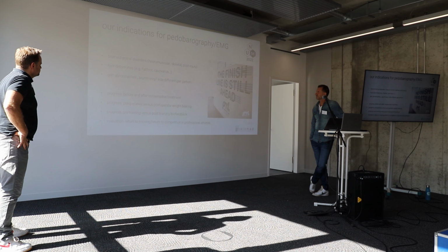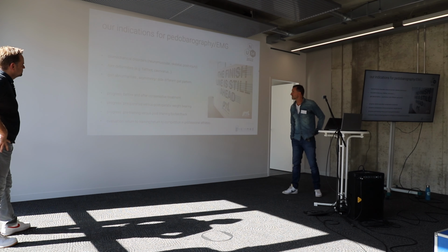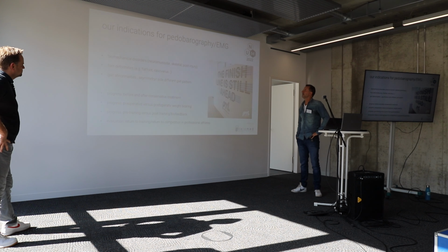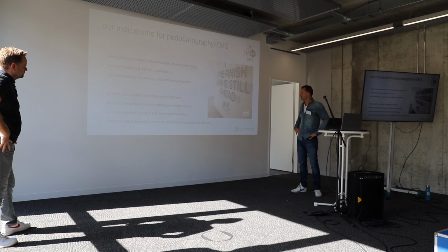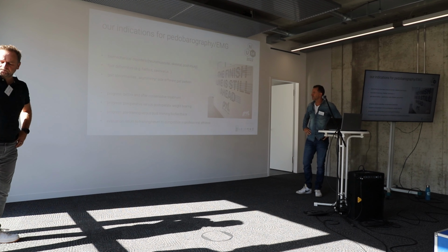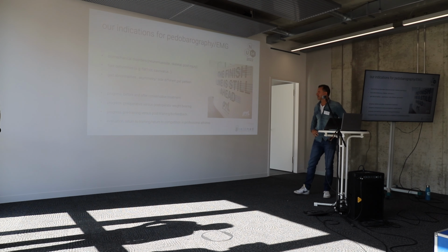In general, for me as a foot and ankle surgeon, it's everything of biomechanical disorders, foot deformities, gait abnormalities, and most of all different gait patterns. And we also want to document the progress before and after conservative treatment, before and after operative treatment, and also before and after an individual and sport-specific training.